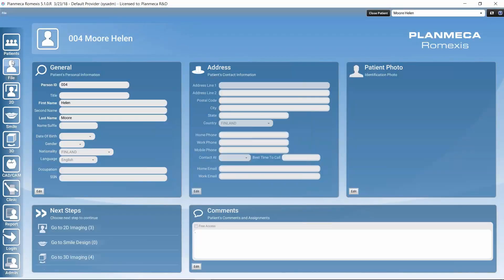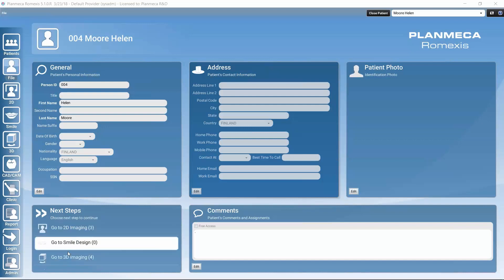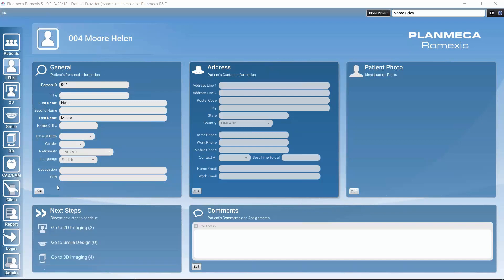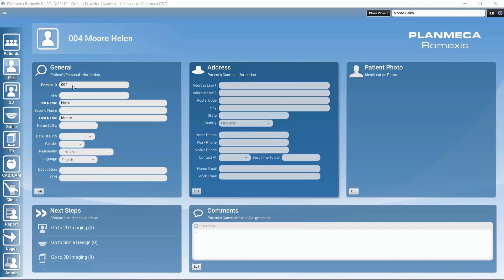Clicking a patient opens the file module, which contains information about that specific patient. The imaging modules also become active at this point, allowing navigation to any imaging module with this patient's information. In this view we can edit the patient's information, add more personal details, modify existing information, or add address information.